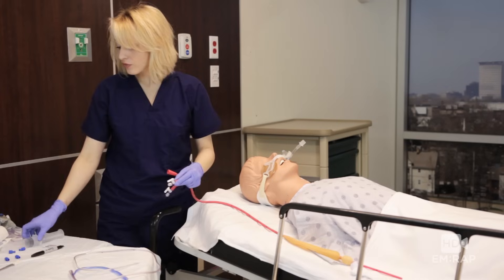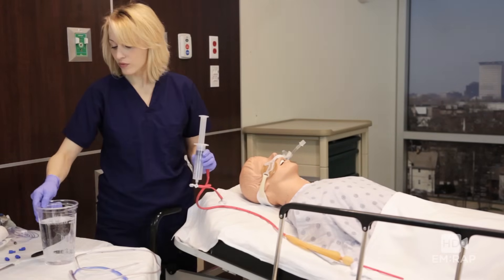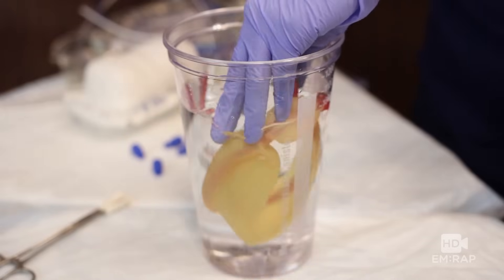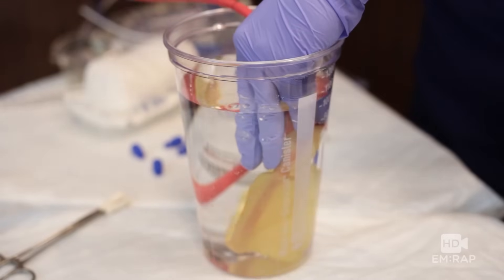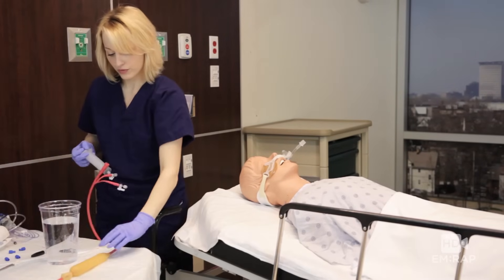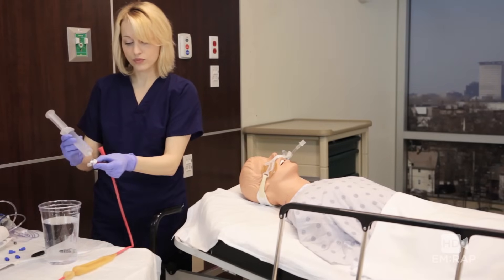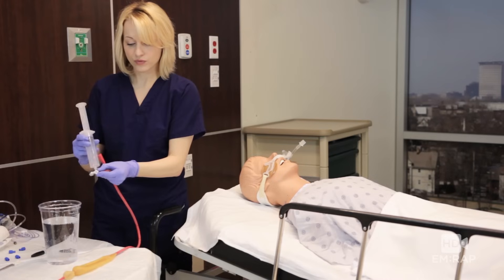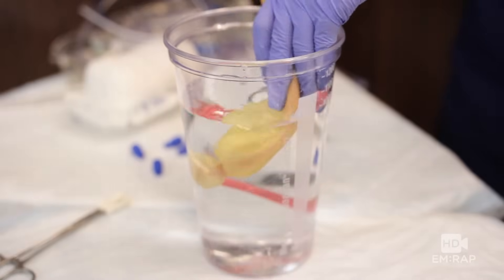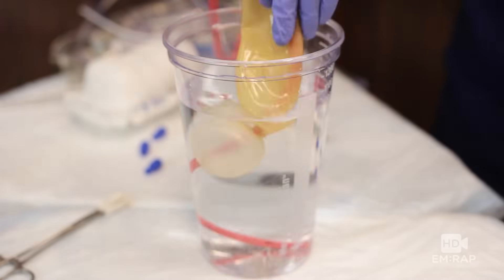Now we're going to test to make sure our balloons don't leak. Take your 50cc syringe, connect it to the esophagus balloon port, and dunk it in some water, inject some air, and make sure we don't see any bubbles coming up. Once that looks good, deflate it and test the gastric balloon — same sophisticated technology: dunk it in some water, inject some air, and check for air bubbles.